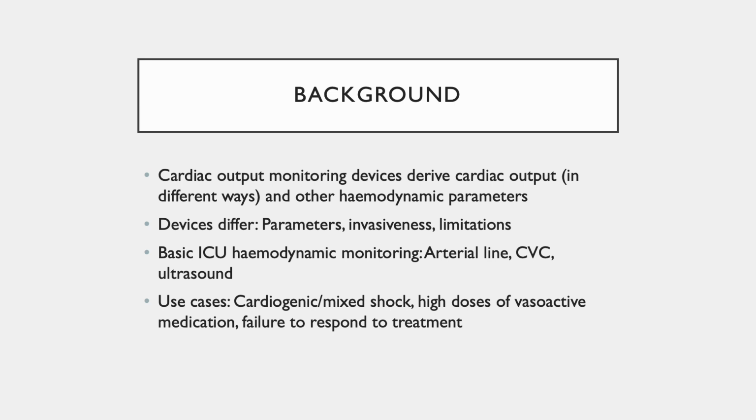In patients with cardiogenic or mixed shock, or those who require high doses of vasoactive medication or do not respond to initial treatment, more invasive monitoring may be considered to provide additional information to guide management. Importantly, the values produced from these monitors should be taken in context of the patient's clinical condition alongside other data points like the lactate, central venous oximetry, CO2 gap, as well as end organ function.